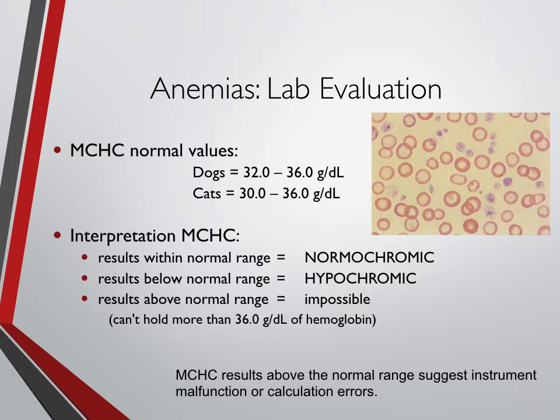They really don't look very well filled at all. I think I can see one normal red blood cell on this whole slide that has the appropriate amount of hemoglobin within the cell. So this is a very hypochromic sample. Also, very large and excited looking platelets on the sample too.